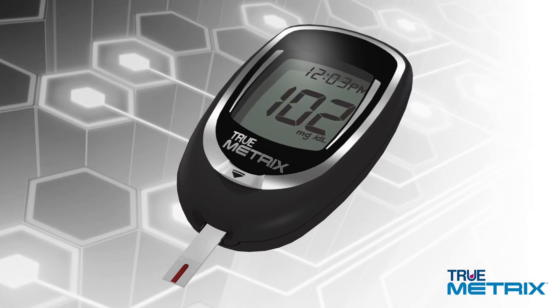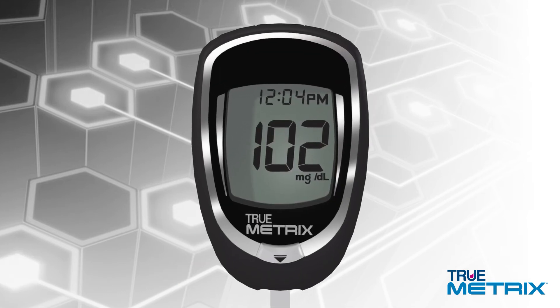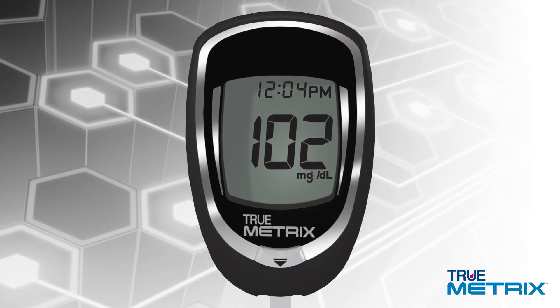In as fast as 4 seconds, your blood glucose result is displayed in the meter. This test result is automatically stored in your meter's memory, including the date and time of the test. If you choose to tag your results using the event tag symbols, those will also be stored in the memory along with your results.